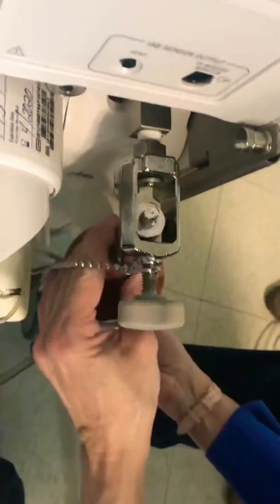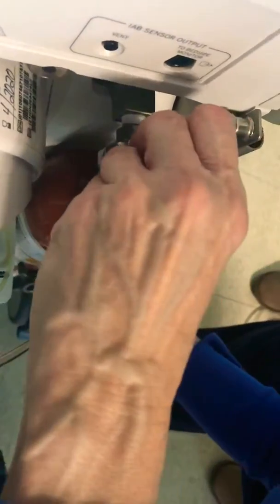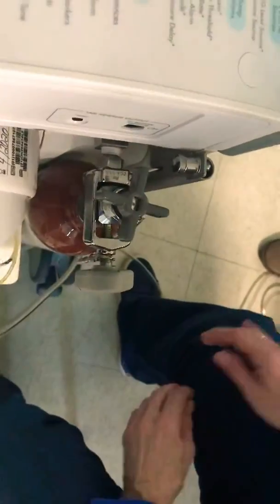Take your new tank. Tighten this all the way in. And then open your new tank all the way. And then you'll see your tank.